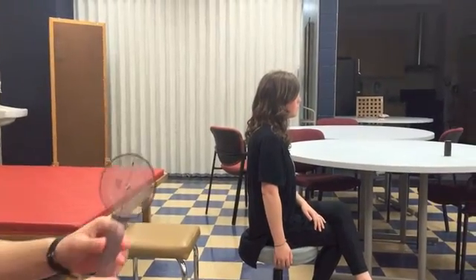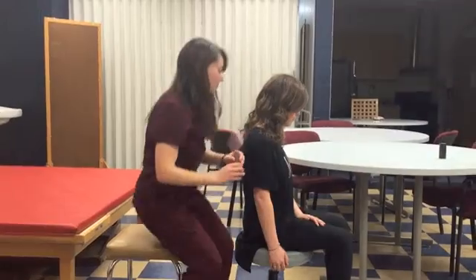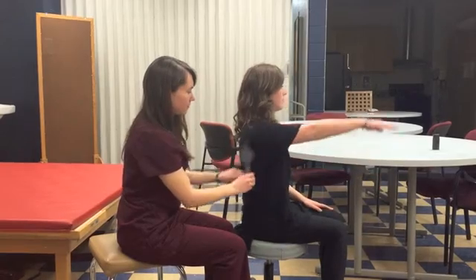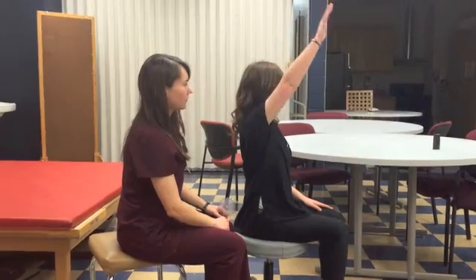Have the patient in a seated upright position with their feet, knees, and hips all at 90 degrees. Ask the patient to actively raise the shoulder forwards and observe for muscle contractions, signs of exertion, or any abnormal substitutions.